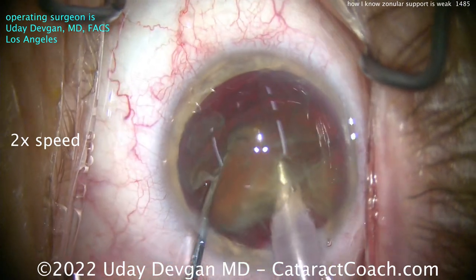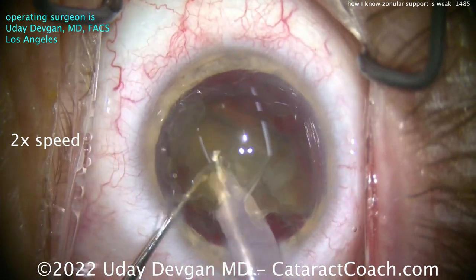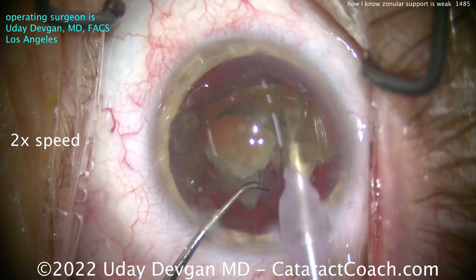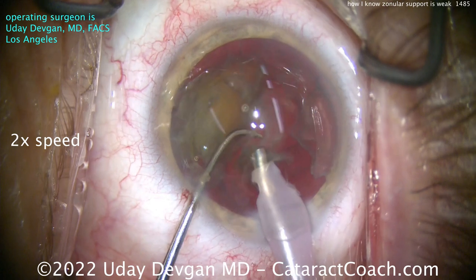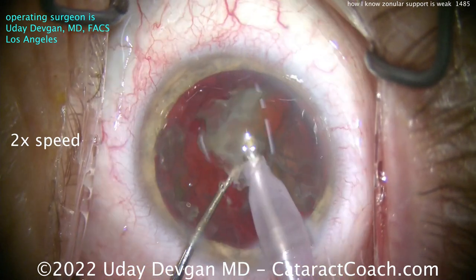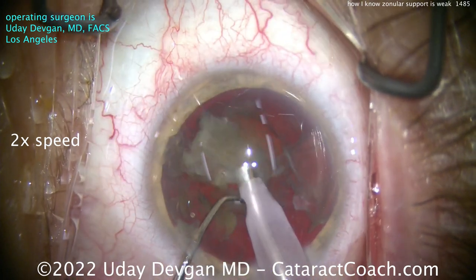Let's start breaking up this nucleus into more pieces. At this point I tell my circulating nurse: please get me a capsular tension ring. I've asked for the largest one — the 12 millimeter capsular tension ring — and that's going to be brought to the operating room. I may or may not use it, but at this point I'm pretty convinced I am going to use it; I'd like to have it available.